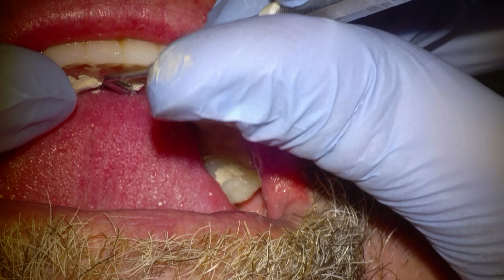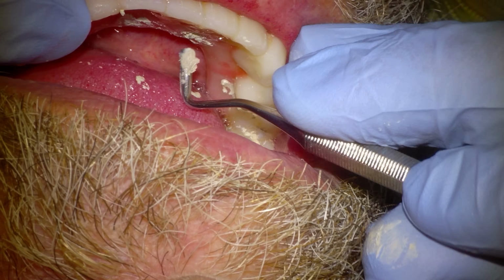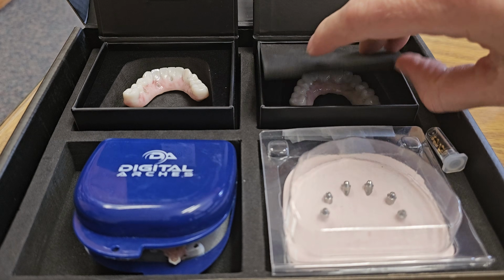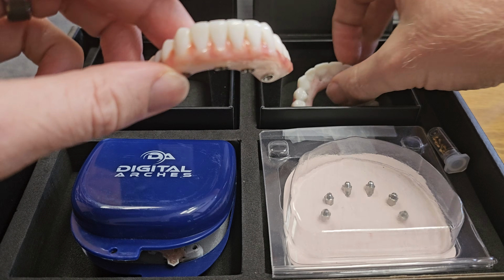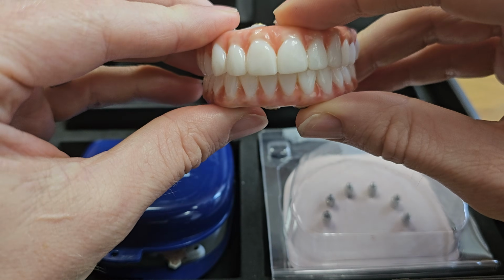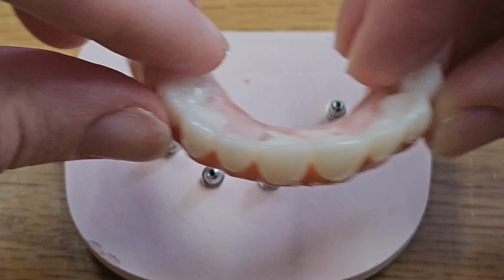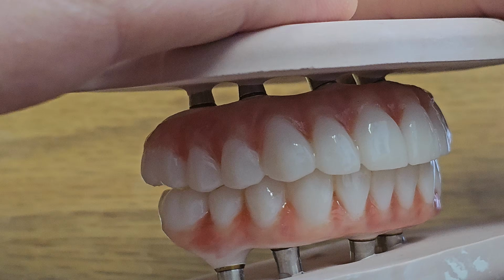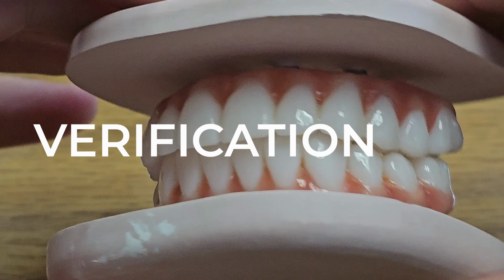Anyway, we put these back in and we'll get the new provisional dentures back in a couple days. So in between the appointments, we get the new provisional back, and I always personally first verify the fit of the prosthetic on the analog abutments that we have set in stone, so I don't get a surprise on the actual day of the appointment. Thus, it's called a verification jig.